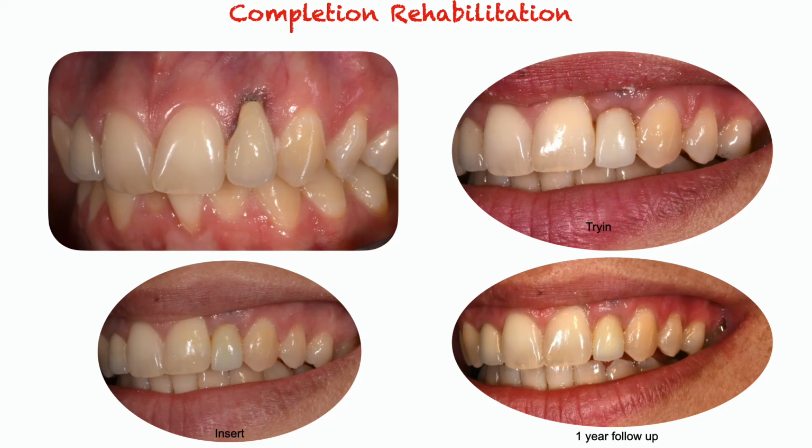So it's an excellent question. Biotype's a key. She's got thin tissue. How much surgery has she had done? How deficient am I? How close am I to my final endpoint? That determines how long I take, anywhere from 3 to 6 to 9 months. How critical is this? This is her esthetic zone. I mean, this is her speaking smile. She's not even giving me an exaggerated smile. She's got a high, broad, gummy smile. So the bottom line is, you see everything, which is why I sent back the crown, which is why those little things make all the difference.